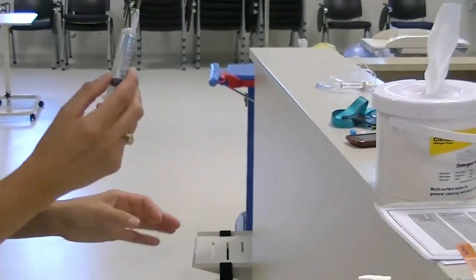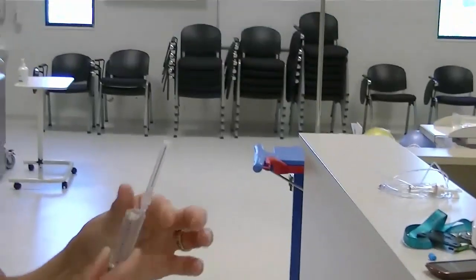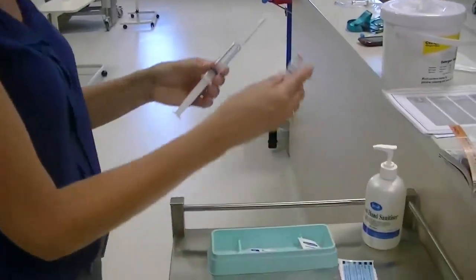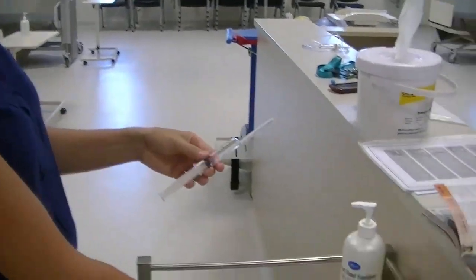Now I'd previously done my calculation and I knew that I had to administer the whole 1 gram, so that would be 1,000 milligrams over 1,000, and I've got 10 mils of water, so I need 10 mils.